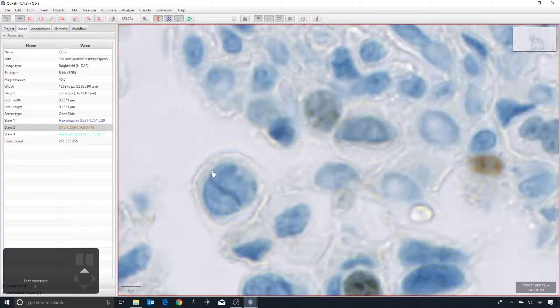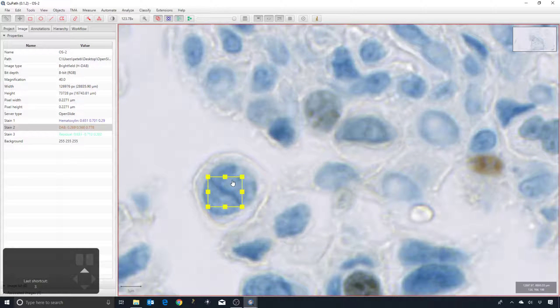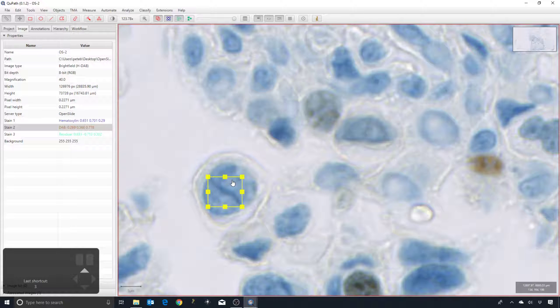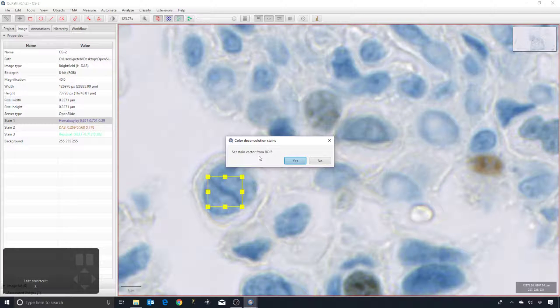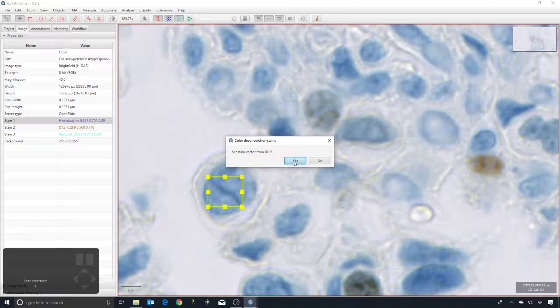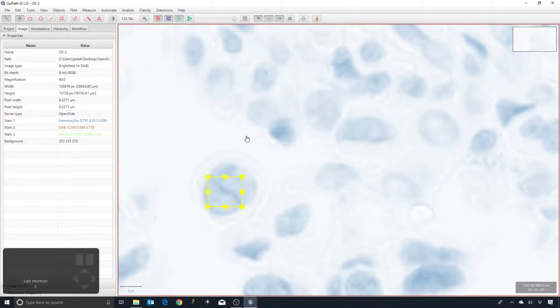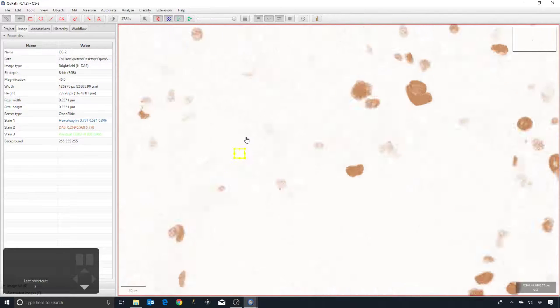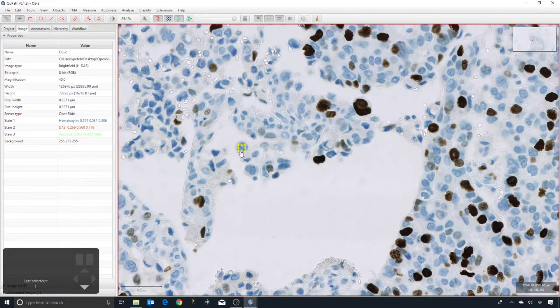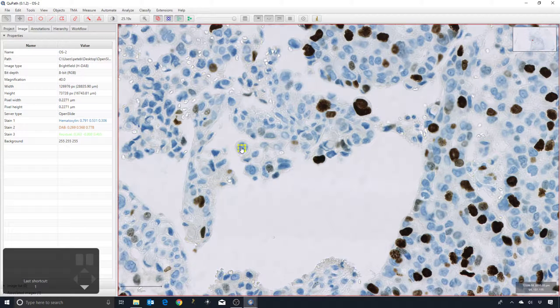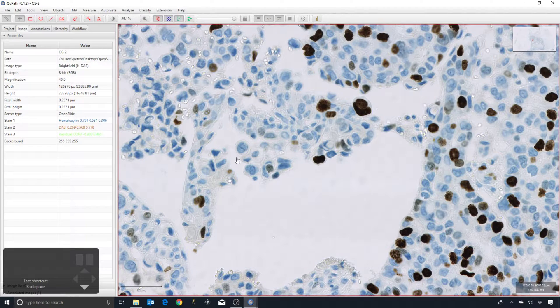If you don't happen to know what a sensible stain vector would be, what you can also do is you can draw a small rectangle in a suitable area. I'm going to say I want to teach QuPath that this is what the hematoxylin looks like. Basically it'll just use an average value from within this small rectangle. I can double-click on the hematoxylin. It asks do I want to set the stain vector from the region of interest, so the ROI. I say yes and you can see it slightly modified then the stain vector.